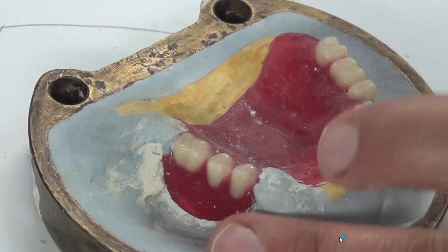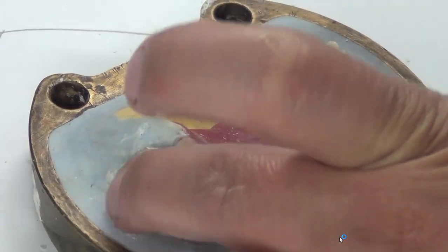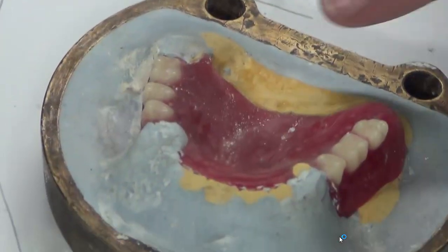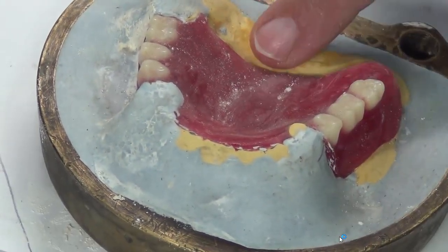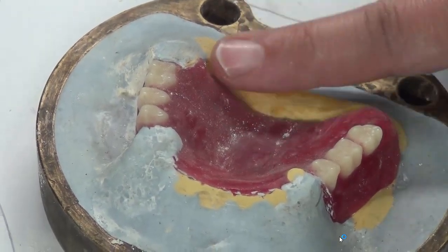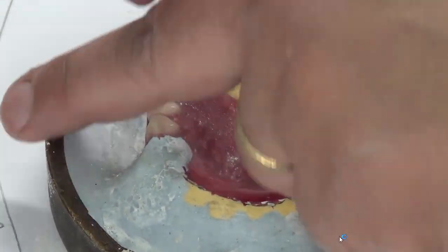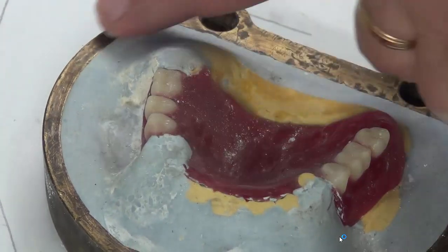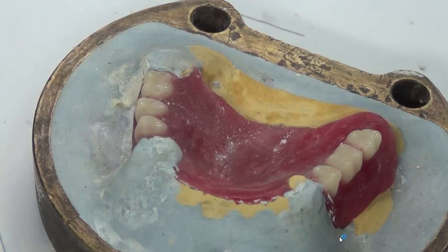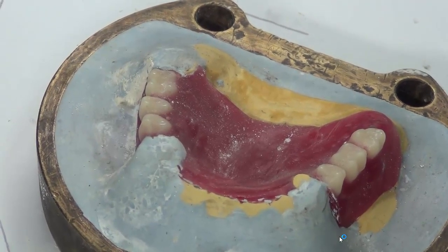And all surfaces are smooth, from the cast, from the wax margin up to the rim. So here, from the wax margin up to the rim, it's smooth. Although you see some part of the cast showing, it's smooth, okay? And the rim of the flask is all clean. These are the features we should get after we finish the first layer of flasking. Okay, 5 to 10 minutes for this step, please.